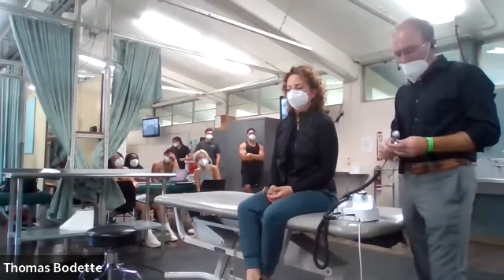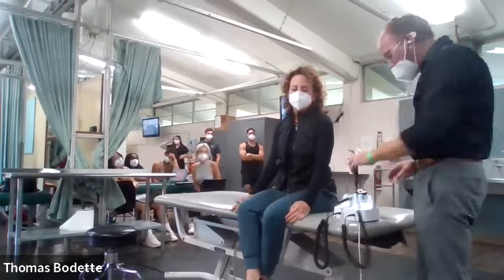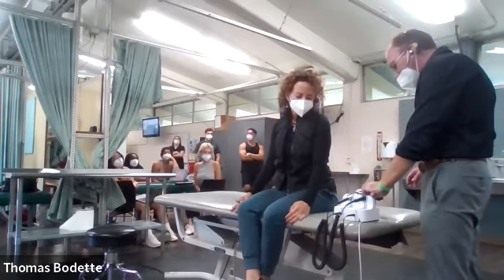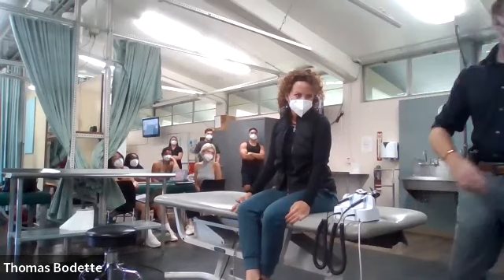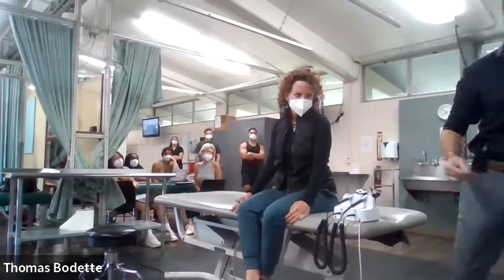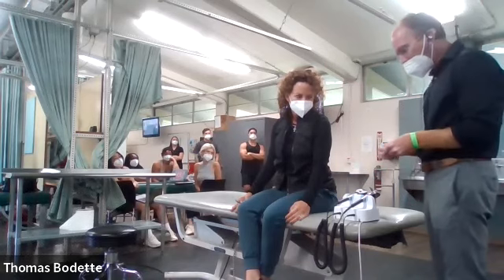So that's pretty much it. Then my machine here, all I have to do is just put it back down in its spot and it turns off. And you probably also want to get into the habit of cleaning it right before and after, which I'm going to do right now.